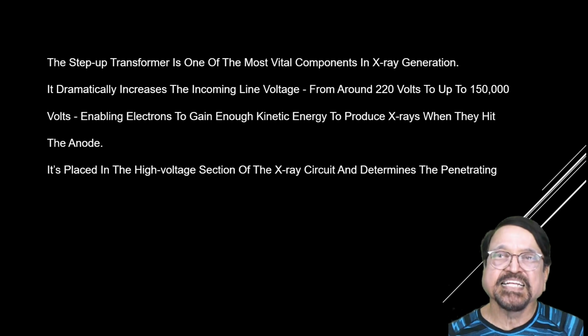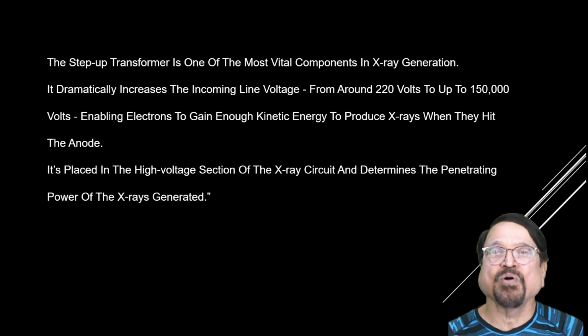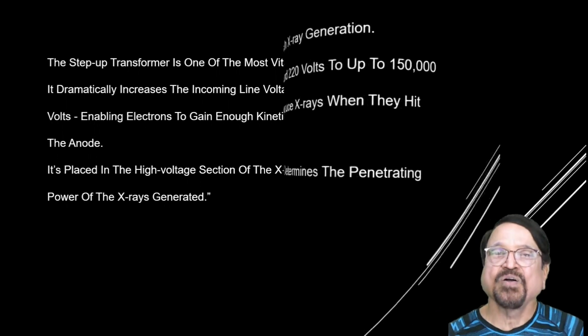It is placed in the high voltage section of the X-ray circuit and determines the penetrating power of the X-rays generated. If you use less penetrating X-rays, it will result in a foggy image. It will not give an informative image.